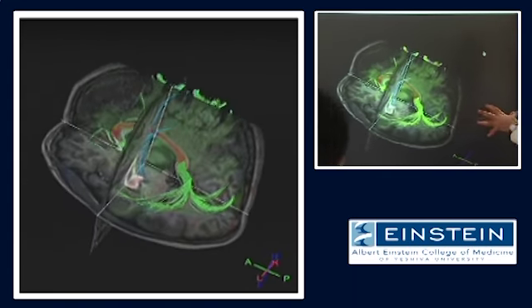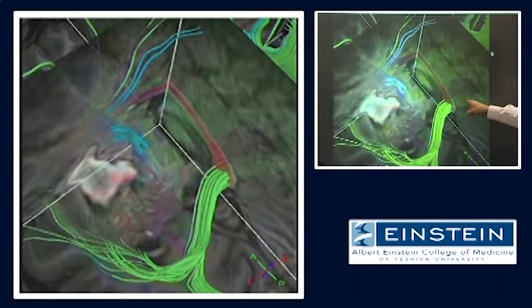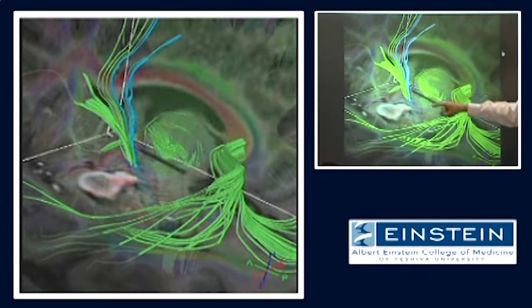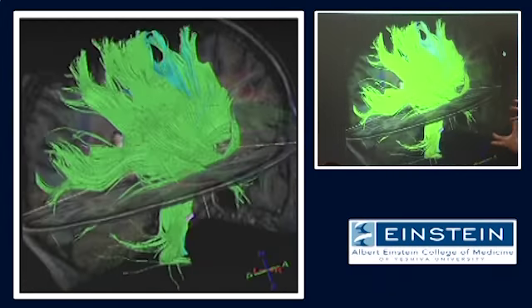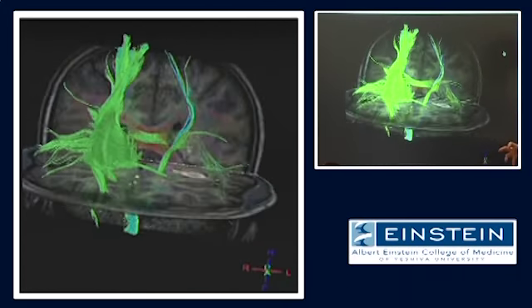Okay, so it's a 3D volume, and for example, you can see fibers in the corpus callosum or part of the corticospinal tract as it relates to the tumor. And it's a complete 3D model that you can turn around and understand the relationship of the anatomy to structure.